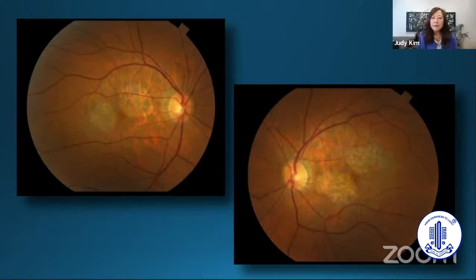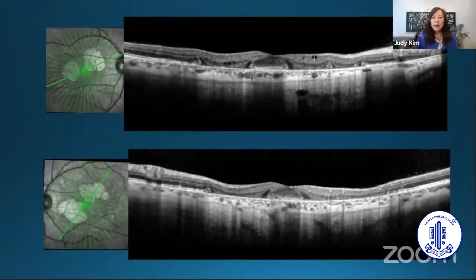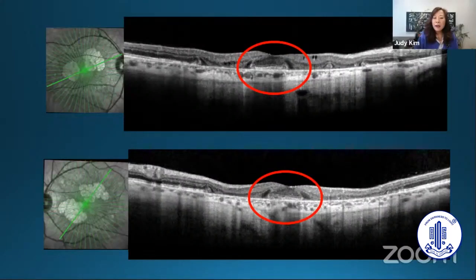And this is the OCT finding. You do see the areas of atrophy perifoveally, but the fovea itself is spared. So perhaps that's why she has 20/20 vision. But some of you might say, oh wow, that sort of looks like the flying saucer sign that we sometimes see in certain conditions. So you sort of keep that in mind.